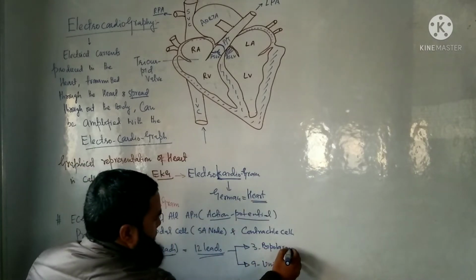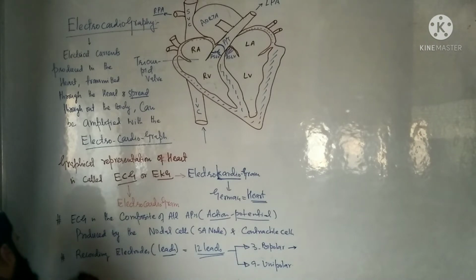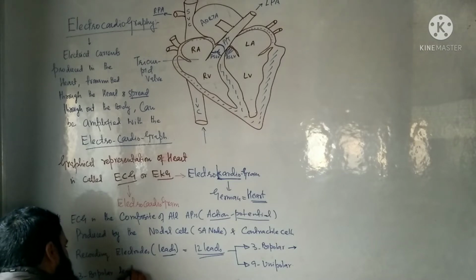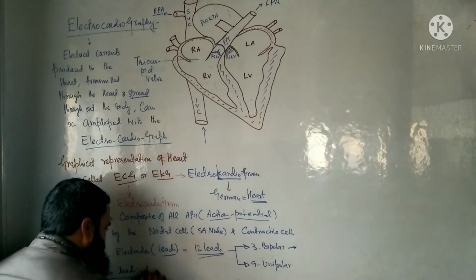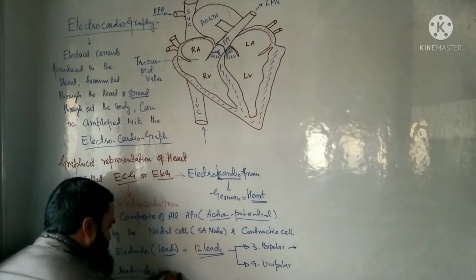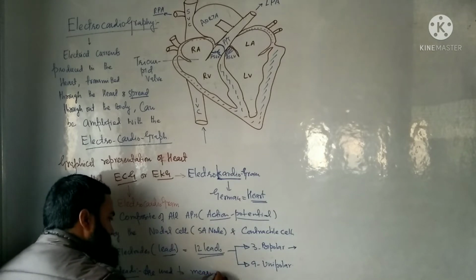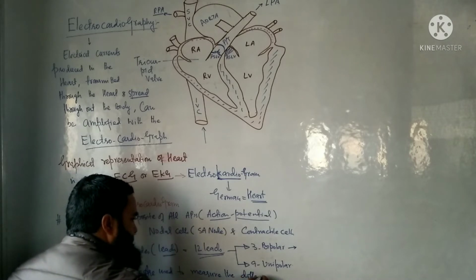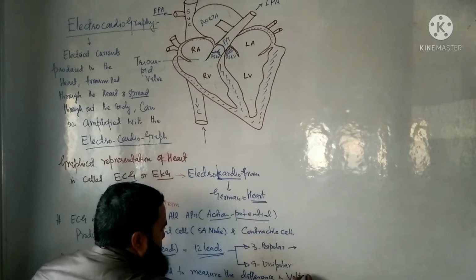The 3 bipolar leads are used to measure the difference in voltage.